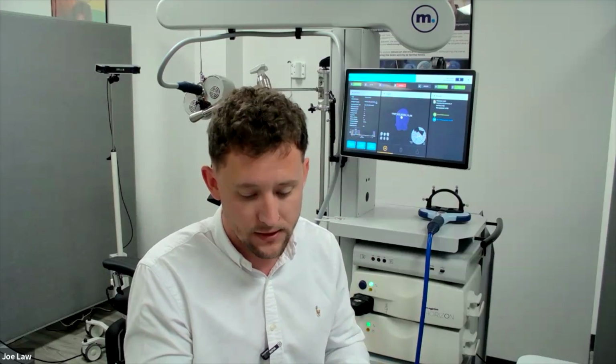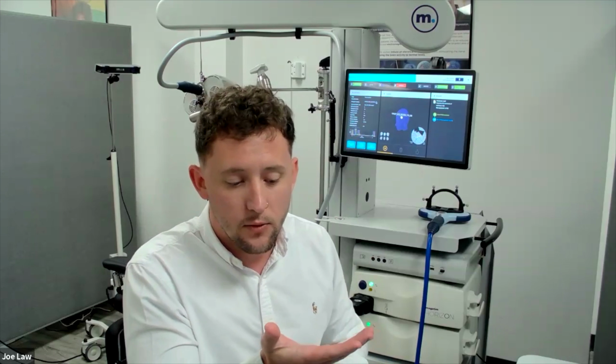Sure. Traditionally, and I'm just going to talk about MDD for the sake of this, the way it works is when you stimulate that motor response during MDD, you're looking for the right hand to twitch, the right thumb to twitch. So traditionally, you'd visually look for that thumb twitch to elicit a response. You would then keep bringing the MT percentage down, the intensity of the magnetic field, further and further down until you could barely see a thumb twitch anymore. And that's around about where the dose would be for that patient.